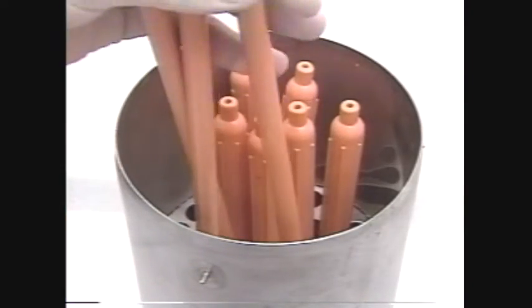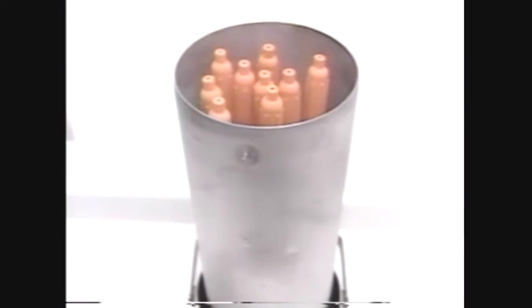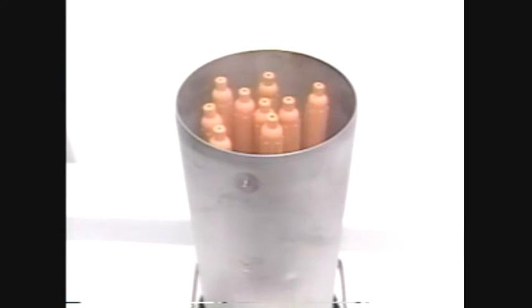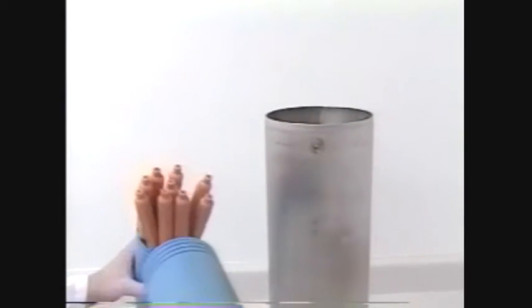The catheter should then be boiled for at least 10 minutes in purified water. This can best be achieved by the use of a mini-tube catheter sterilizer, which is also ideal for drying and storage of the catheters. Separate storage containers can also be used.